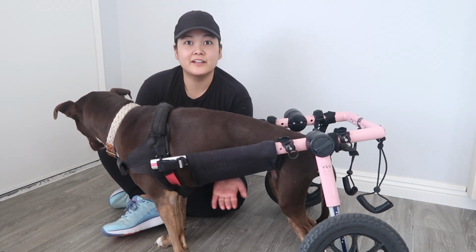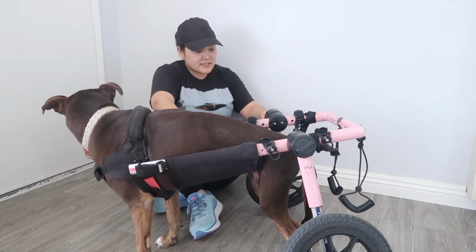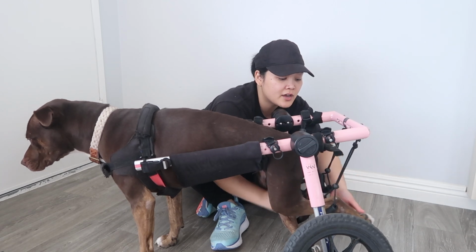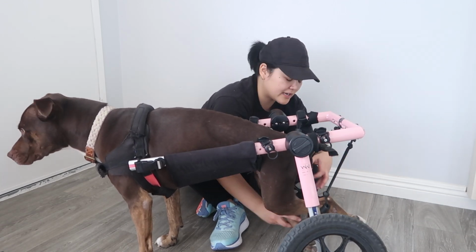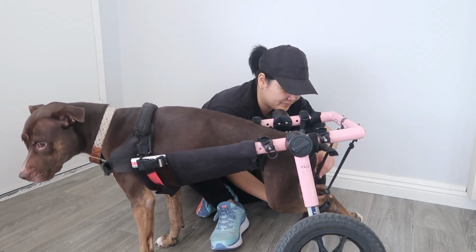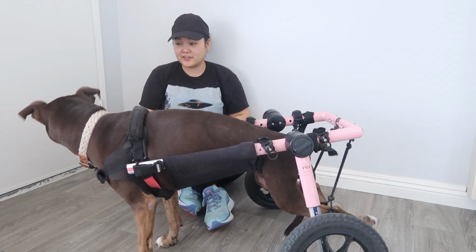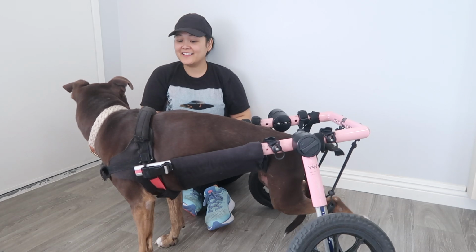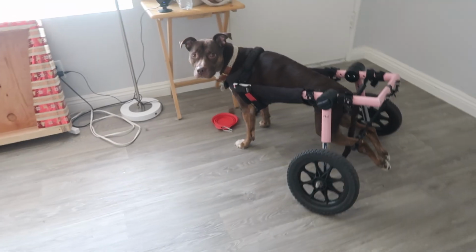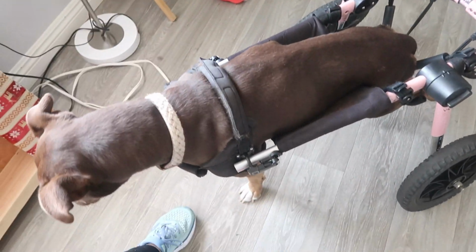Okay, so once we got her good looking like that, we're gonna go ahead and put her little feet in these straps. So we put it right where her ankle is and tighten those babies up. She's doing a little stretch right now. And she is good to go. Are you good? Are you good? Here, go show them a little walk around here. Come on. Does that feel comfortable for you? Are you ready to go for a walk? You want to go for a walk? So there is the pretty lady in her wheelchair, and she is ready to go.